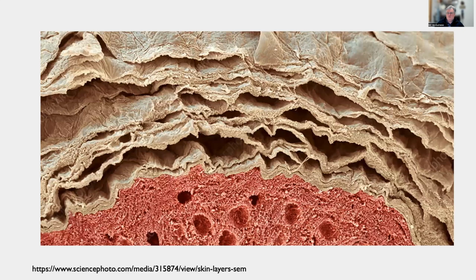So here's an example of a cross-section of skin. When you apply electrical charges across that, it seems they follow specific pathways. Within the same tissue, there are what are known as loose junctions or loose connections, so the electrical stimulus quite easily passes across those tissue layers. However, if the electrical stimulation tries to pass between tissues, it tends not to be as active. It's believed it's because the junction between the two tissue layers is a firm or hard junction. So not only is this electrical stimulation stimulating cytokines and cellular activities to heal the wound, it's probably providing a pathway for the new cells to follow, so you get the same layering of tissue within the skin.